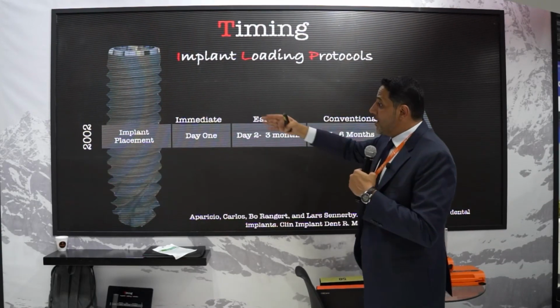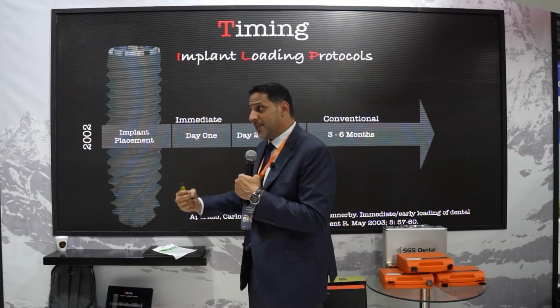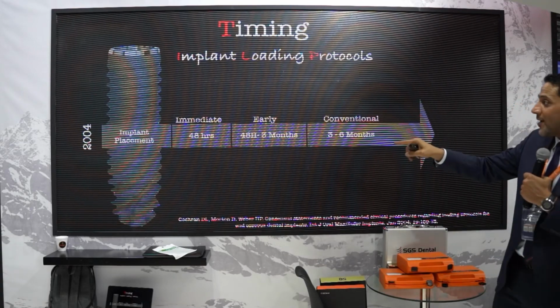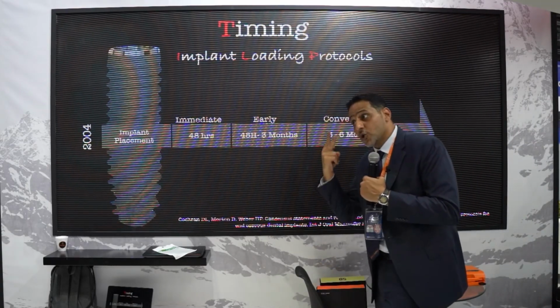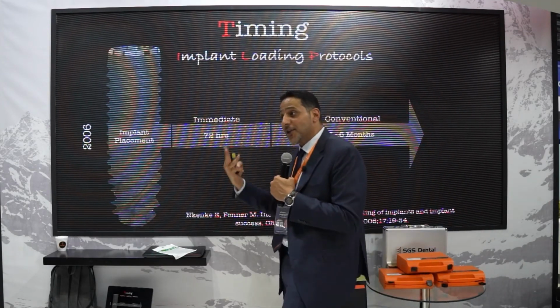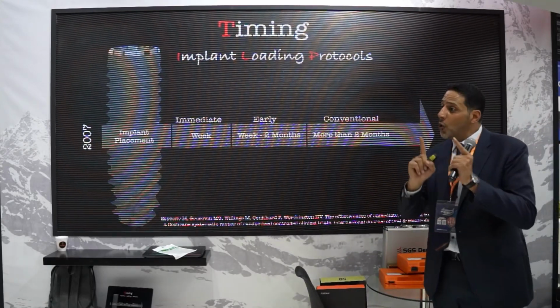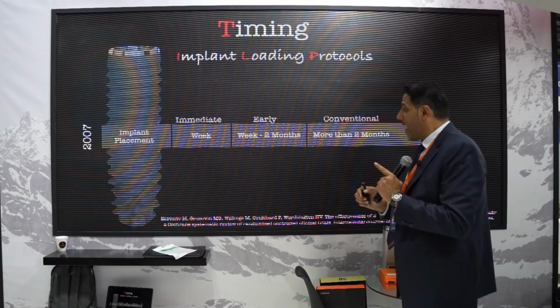In 2002, immediate used to be on the same day. Immediate means that we have to load the implant on the same day. Later on in 2004, it became within 48 hours, not 1 day, 2 days. 2006, within 3 days. 2007, a week. So you have a week to load the implant.